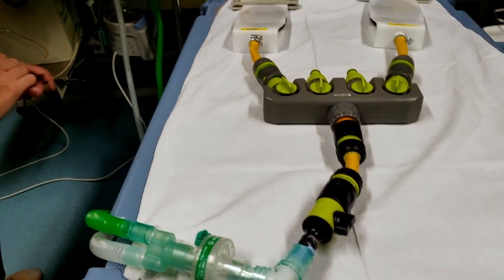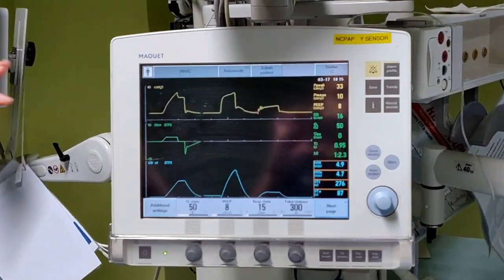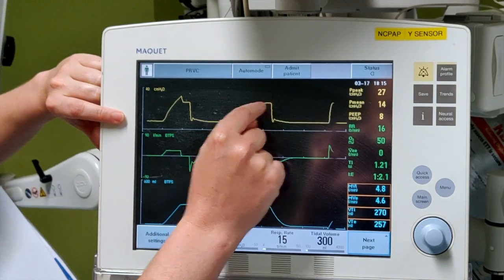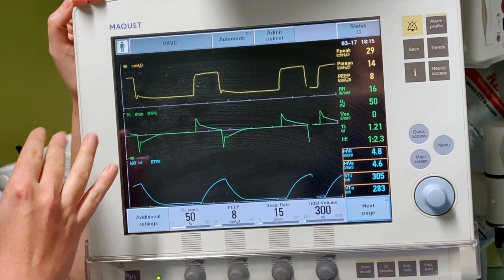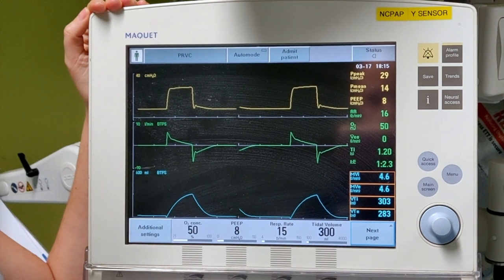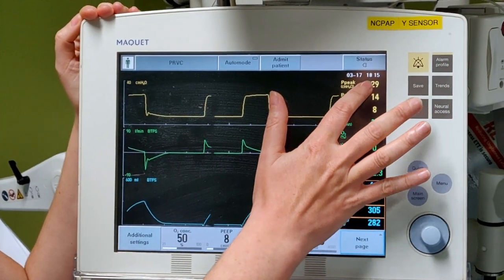If we now make the patient again not resistive but poorly compliant, same thing in our lung simulator. The ventilator has seen such a difference that this brand throws a volume control breath and then finds the alveolar pressure to adapt, and from there readjusts. Other ventilators, for example the Hamiltons, don't have volume control, so it will just increment the target pressure up and up and up until it reaches the 300 it wants. So now we are playing with a peak of 29. The curves look pretty much the same, but this has gone up.